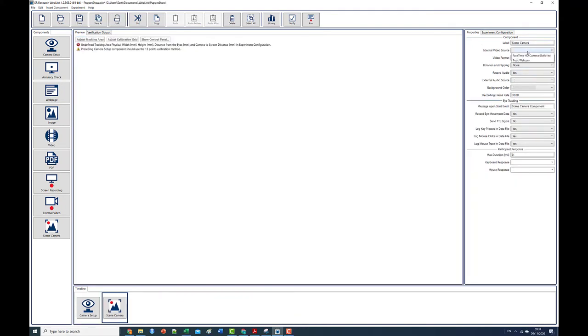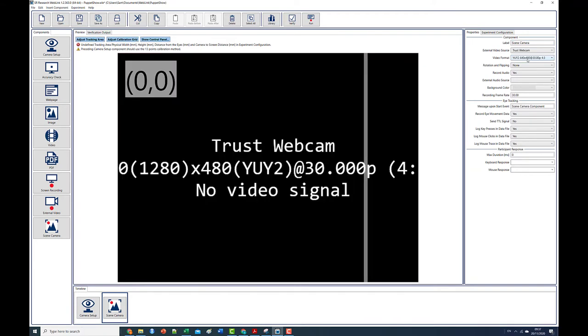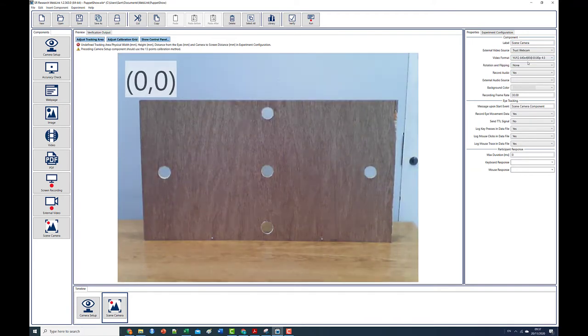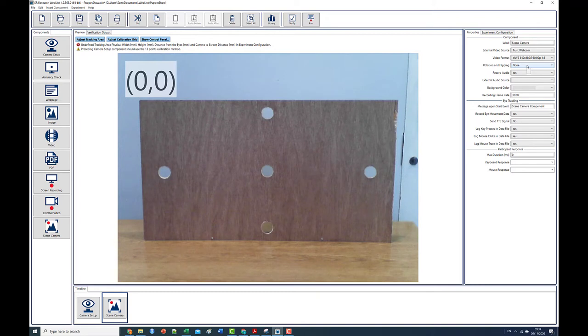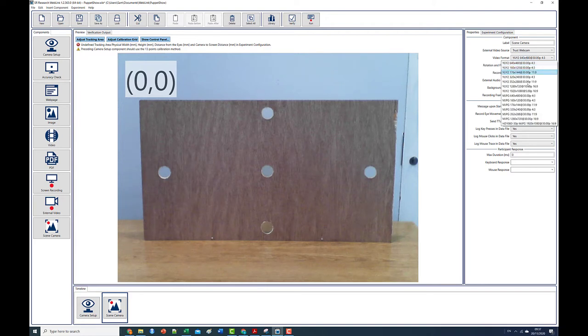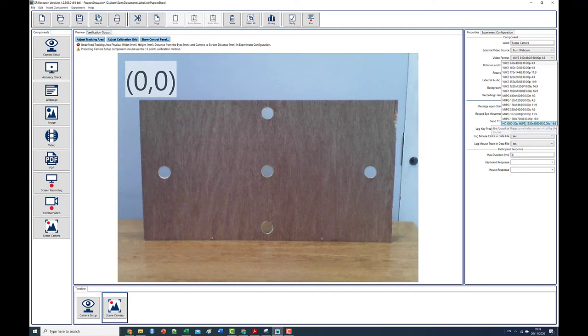Clicking back on the scene camera component, we can select our webcam from the external video source dropdown in the properties panel. If the camera is functioning you should see the video feed in the preview area. Weblink will list the various resolutions and formats that the selected video source supports in the video format dropdown. Select the most appropriate. In this case I'm choosing the camera's native HD resolution.